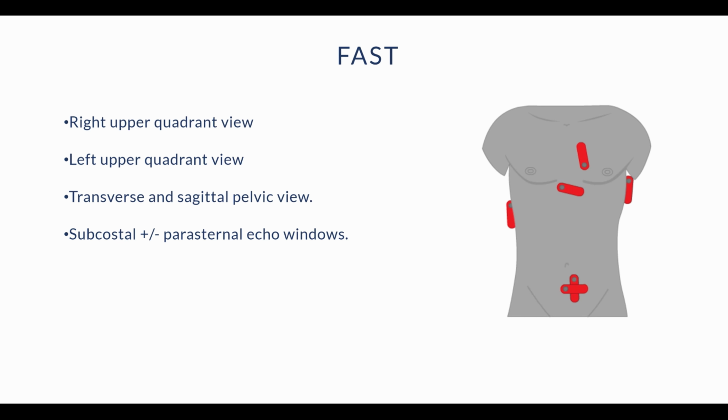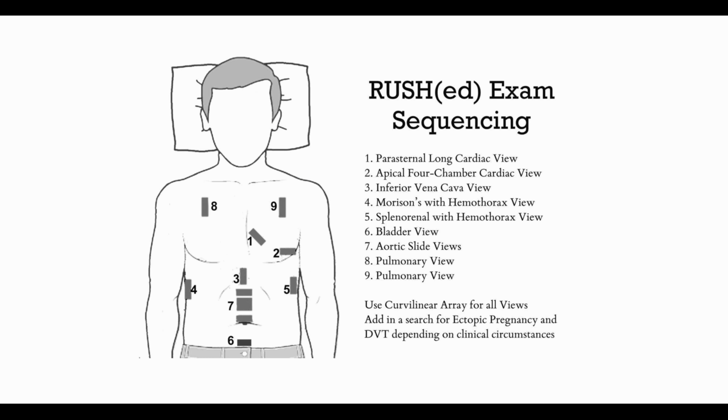The role of ultrasound in trauma has largely been superseded by protocolized trauma CT imaging in major trauma centres, but may still play a role in more resource-limited settings. FAST has, however, introduced point-of-care ultrasound to clinicians working in time-critical scenarios, and has been built upon to create protocols for other clinical states, such as the RUSH protocol, or the rapid ultrasound for shock and hypotension. This protocol only takes several minutes to perform and combines echo, thoracic, abdominal and vascular ultrasound to provide rapid information in patients with undifferentiated shock.